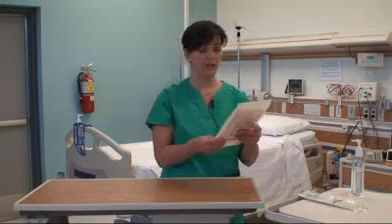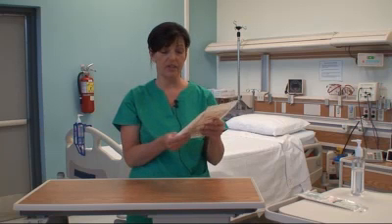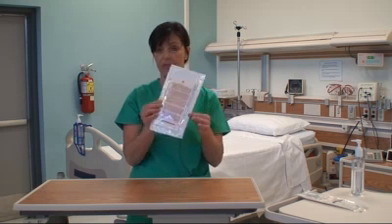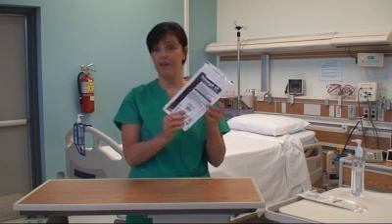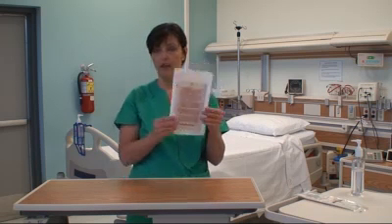When you're getting your sterile gloves, it's important that you identify the size — I wear a 7.5 on my hands. It's also important that you look at the integrity of the package, that it hasn't been dampened or the seal hasn't been broken. Every package of sterile gloves will have an expiry date as well. I've verified that.